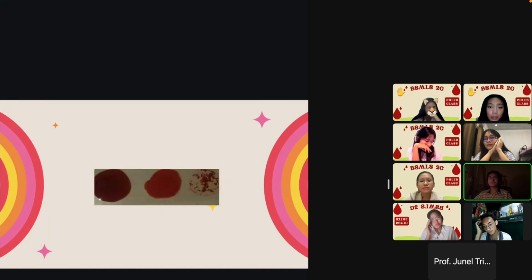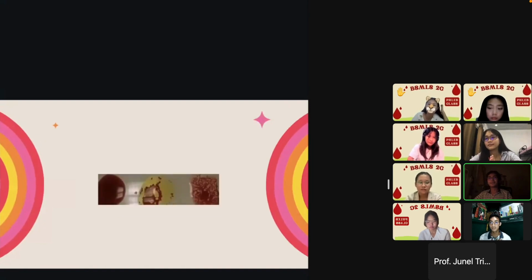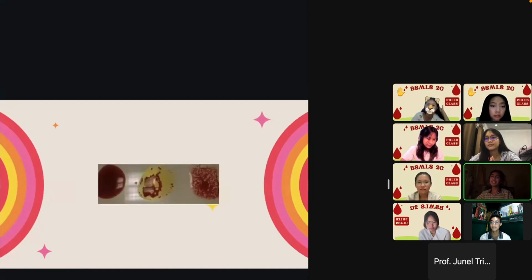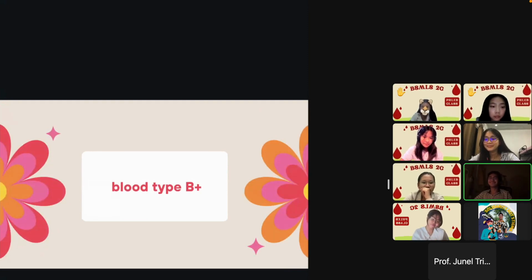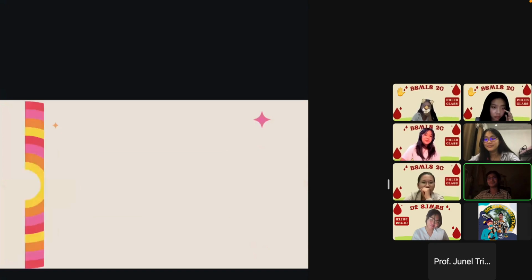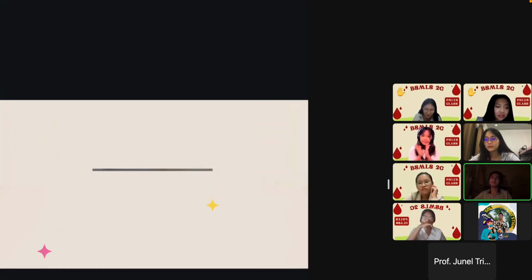Okay, how about that? Sir, O positive po. Okay, tama. Kasi ang nag-agglutinate lang ay yung anti-D. Okay, so anong blood type? B positive, sir. Ayan, tama. O, ano naman yan? Nag-agglutinate lahat. Ano kaya yan? Sir, AB positive po. Yun, tama. AB positive.